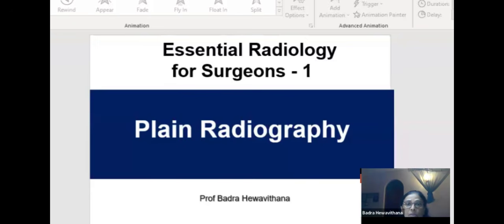So this is a series of lectures on radiology, essential radiology for surgeons. I'll be doing the first lecture, and the topic is plain radiography.